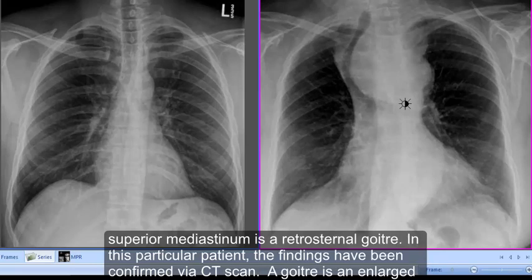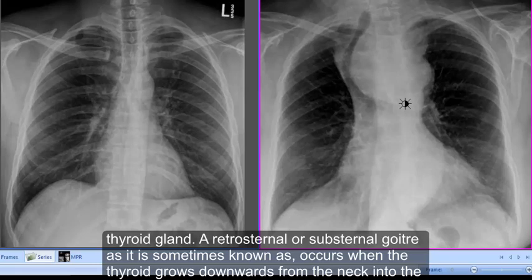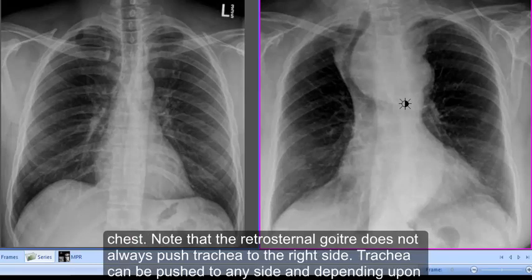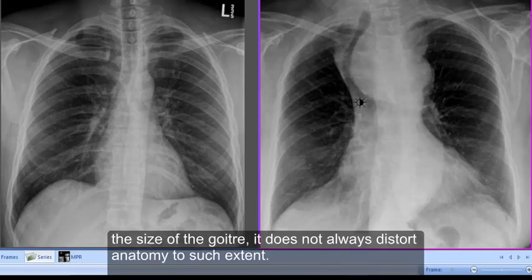The most probable cause of such an appearance in the superior mediastinum is a retrosternal goiter. In this particular patient, the findings have been confirmed via CT scan. A goiter is an enlarged thyroid gland. A retrosternal or substernal goiter occurs when the thyroid grows downwards from the neck into the chest. Note that a retrosternal goiter does not always push the trachea to the right — it can be pushed to any side — and depending on the size of the goiter, it does not always distort anatomy to such an extent.